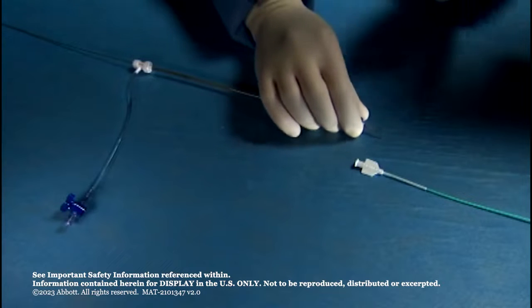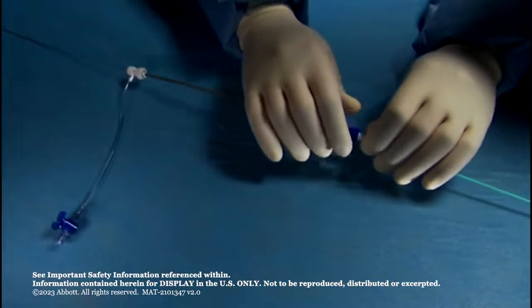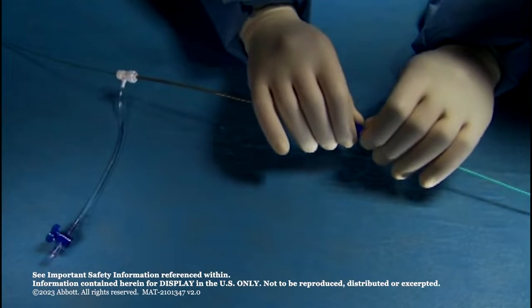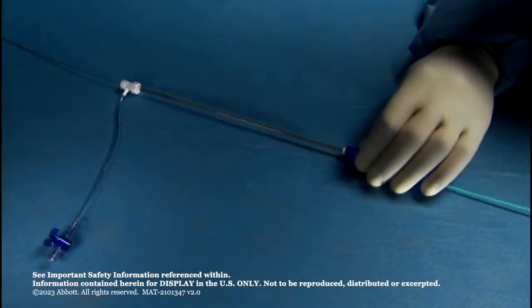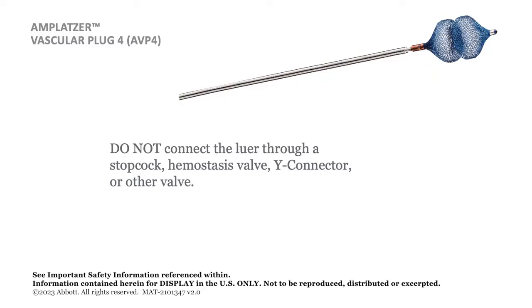Insert the tapered tip of the loader into the hub of the diagnostic catheter. Press the rotating lure to the hub of the catheter and rotate clockwise to ensure full engagement of the loader to the catheter hub. Do not connect the rotating lure through a stopcock, hemostasis valve, Y connector, or other valve, as this will result in damage to the loader.